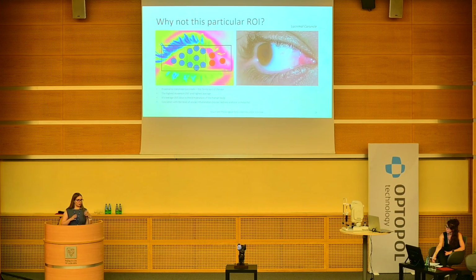So if you, let's say, diagnose inflammation before cataract surgery, as one of the researchers already did, trying to investigate the inflammation before the cataract surgery based on thermography, this is the spot to look for.